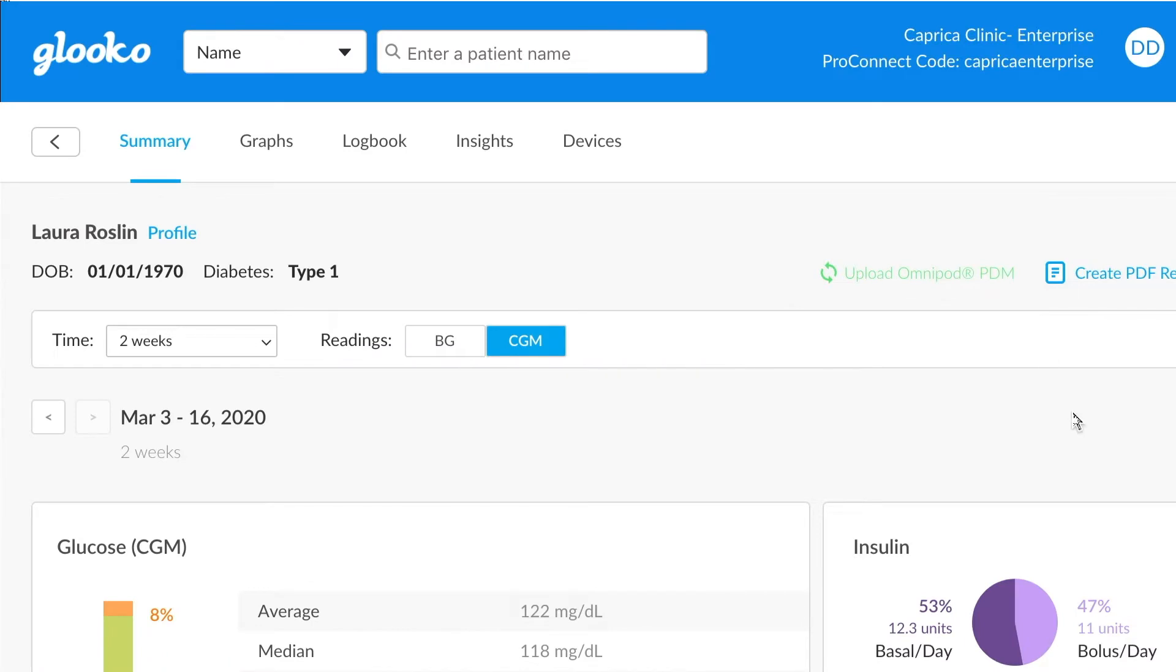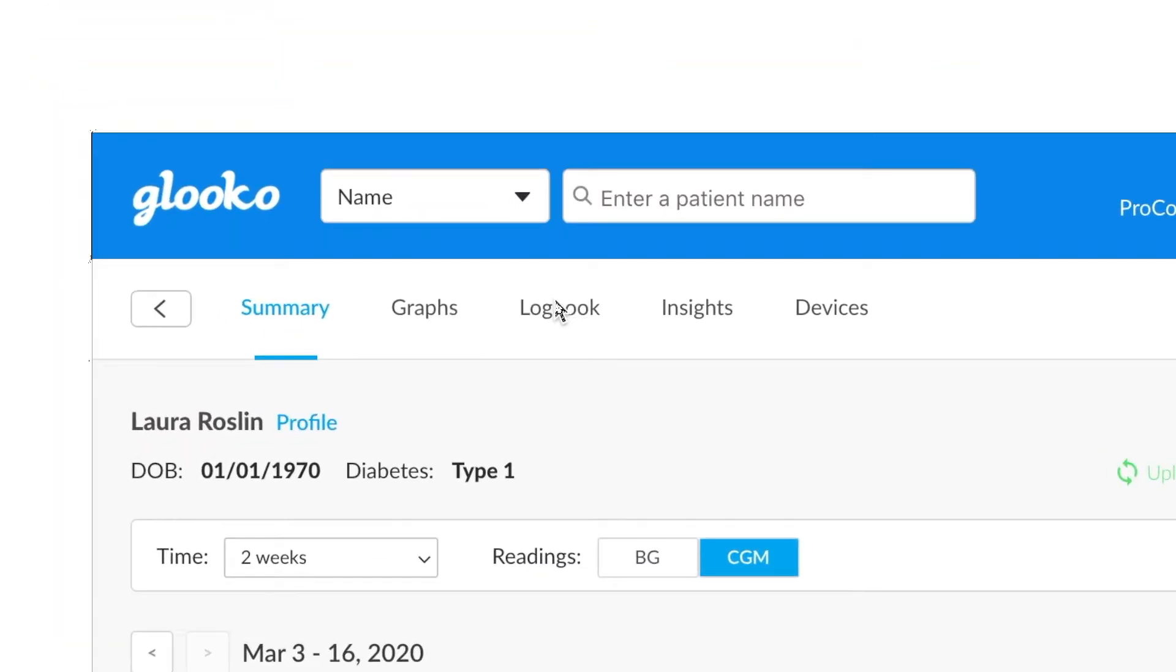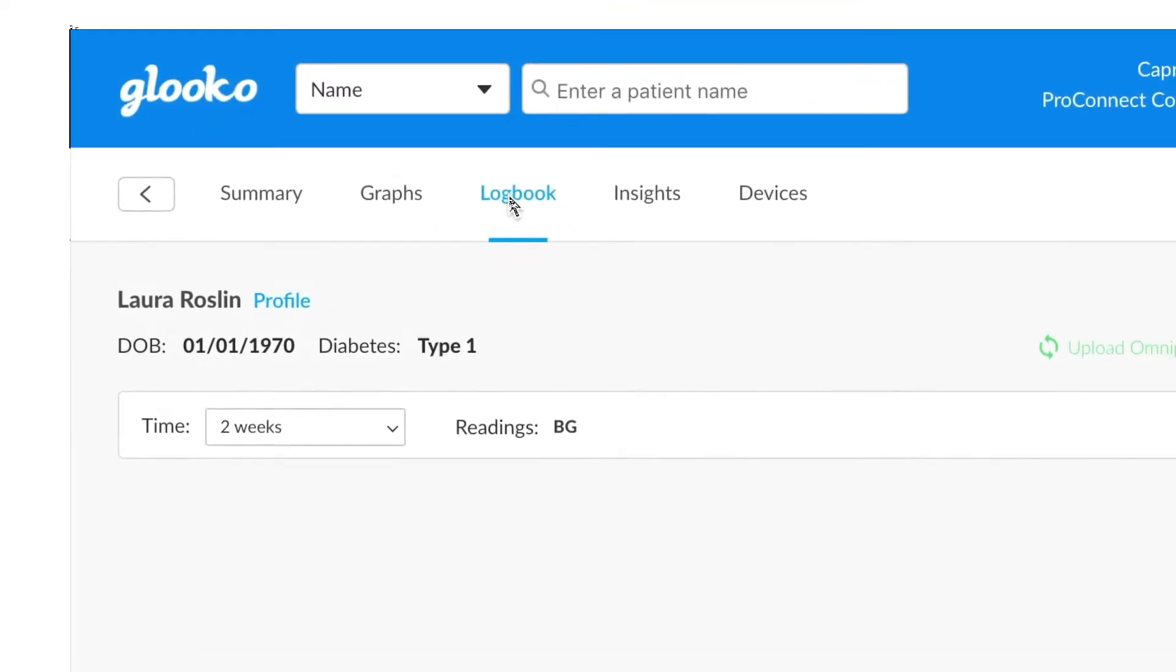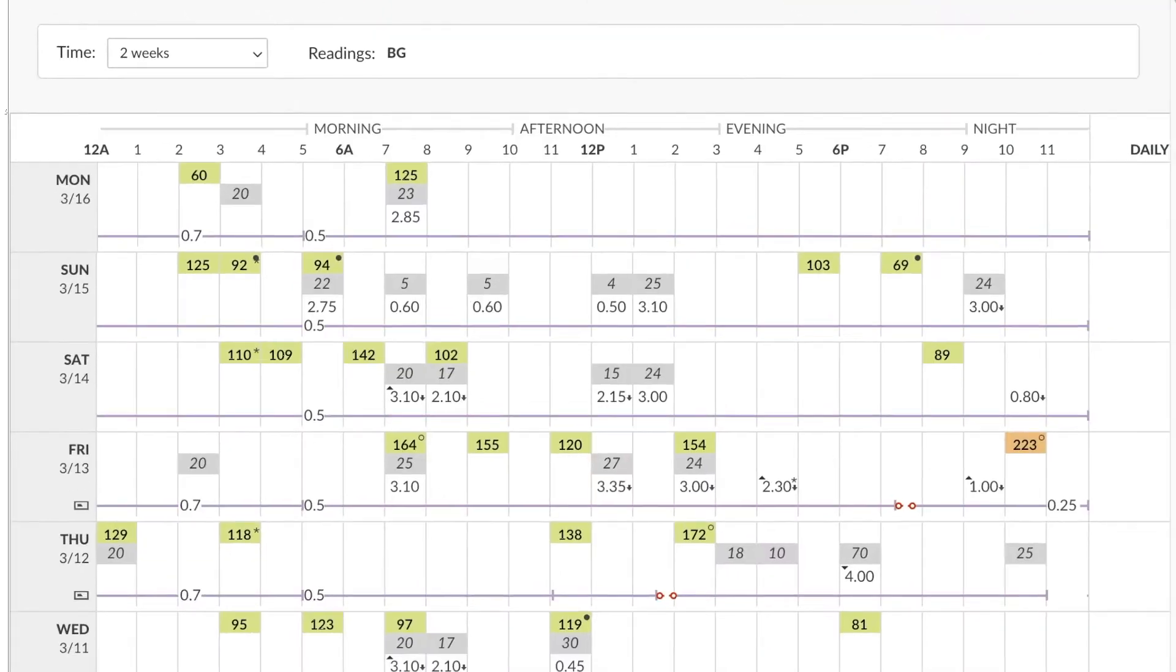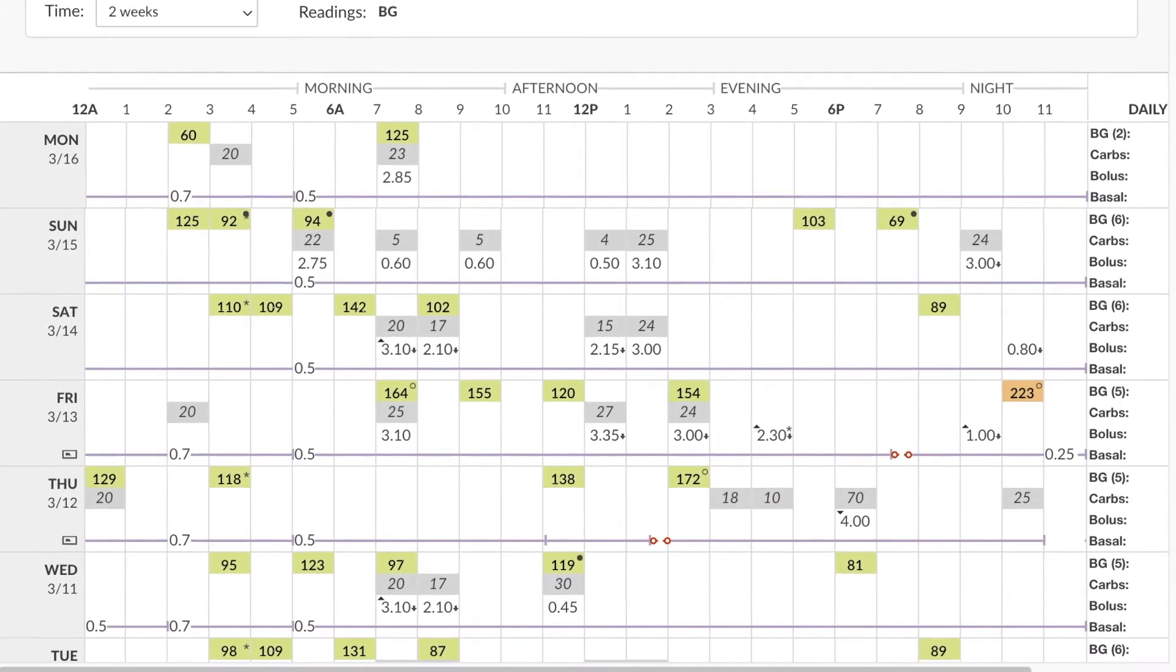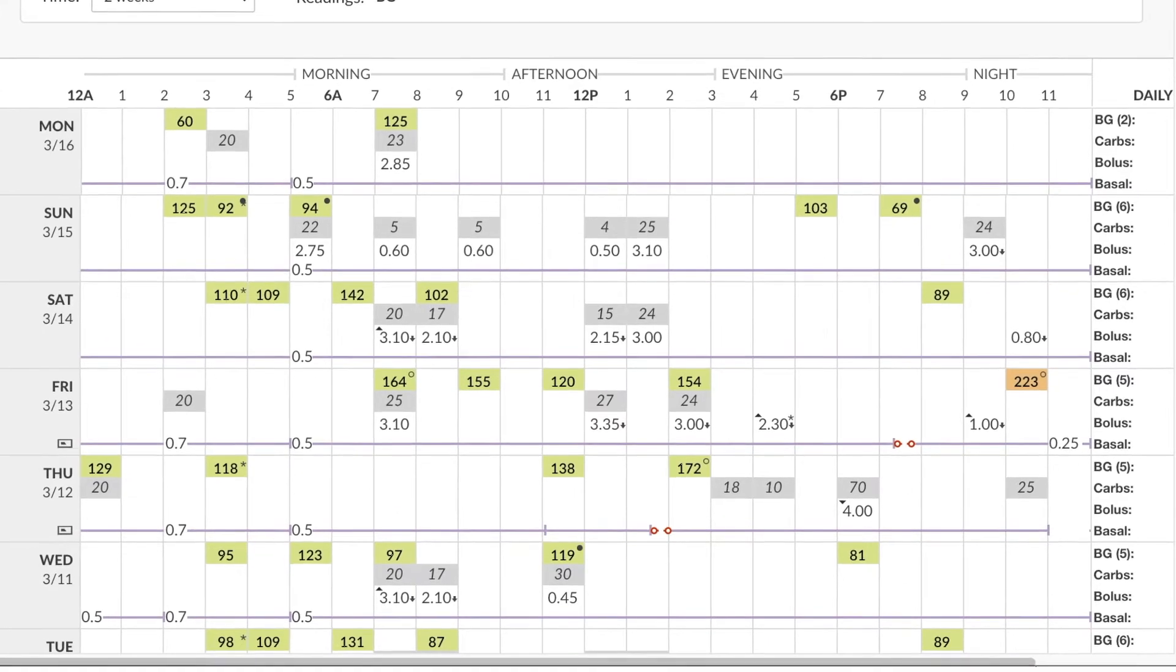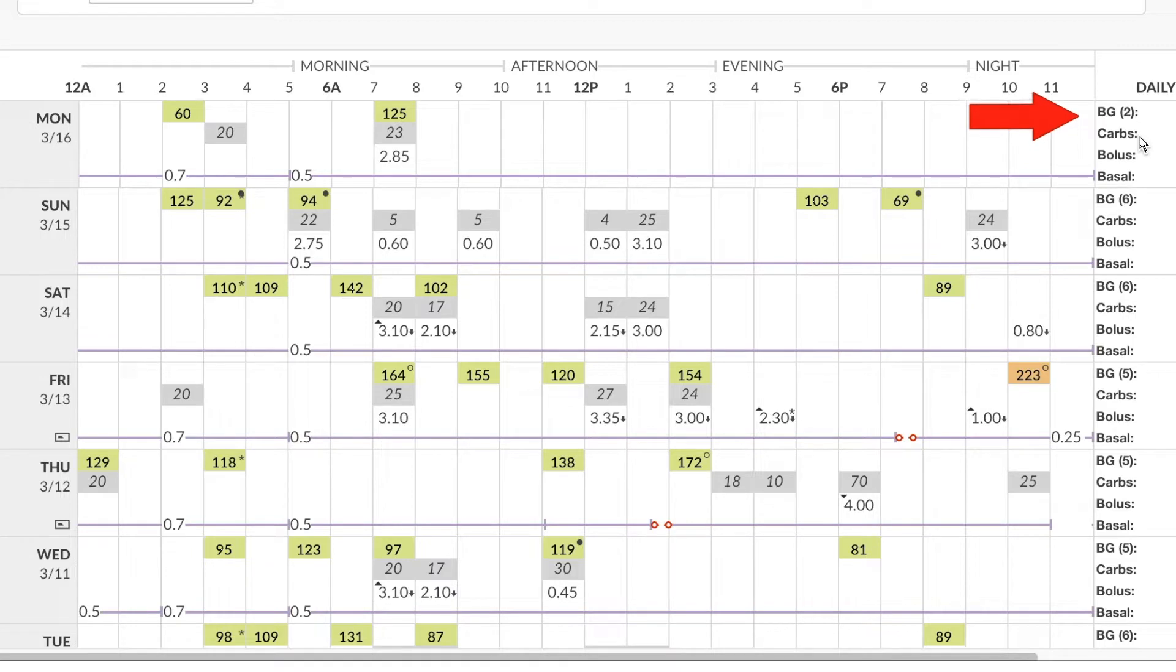One of the other very important sections would be the logbook. From the logbook, which is generally the place where you can see PDM data most clearly, you will see that it is in a graphical view and gives you day by day of basal, bolus, carbs, and blood glucose values.